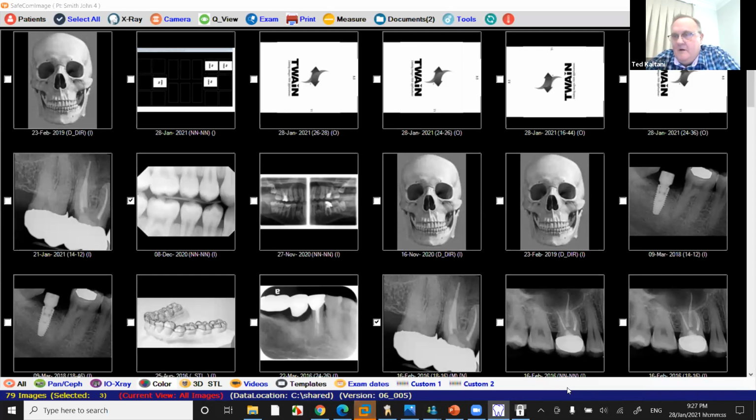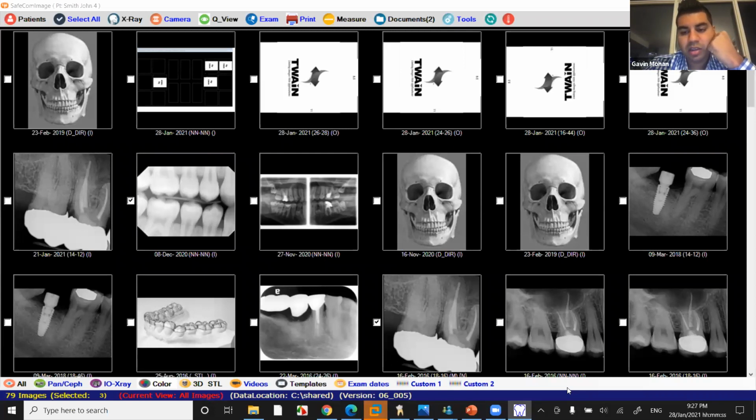Whether it's Mac or the Android operating system or whatever you're using, you need to have a driver. For Mac, there are certain devices, like Planmeca, for example, or some of the Acteon ones, that do have Mac drivers, but most of the dental devices do not have drivers except Windows drivers. Right, so it wouldn't be compatible. I understand.